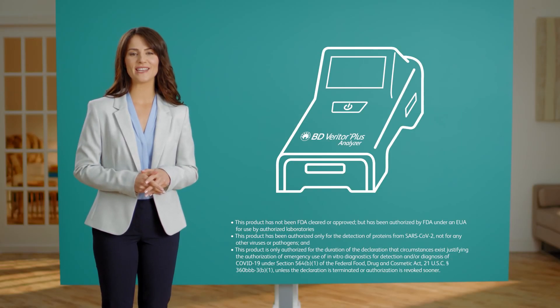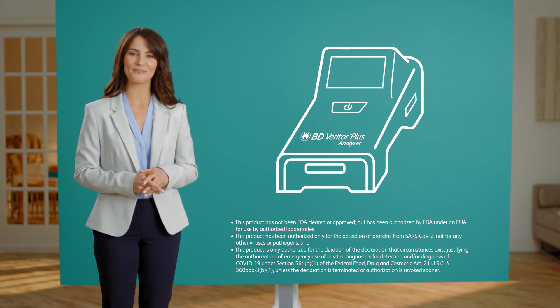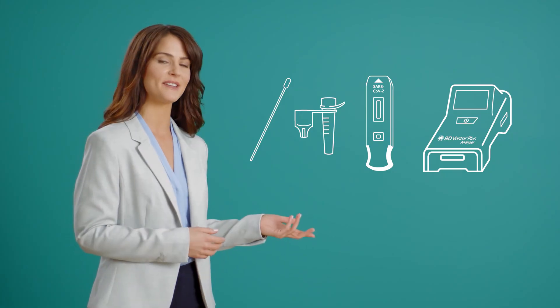Point of care testing for COVID-19 is fast and simple with the BD Veritor Plus system. Before running a test, it's important to gather all the materials that you need to perform the test. Here's what you'll need.